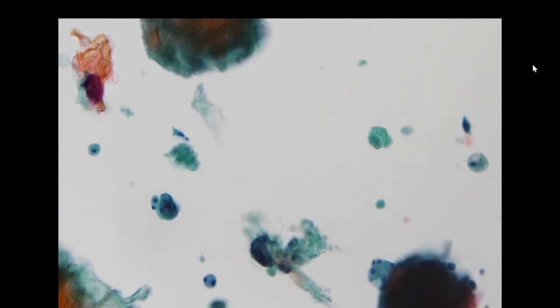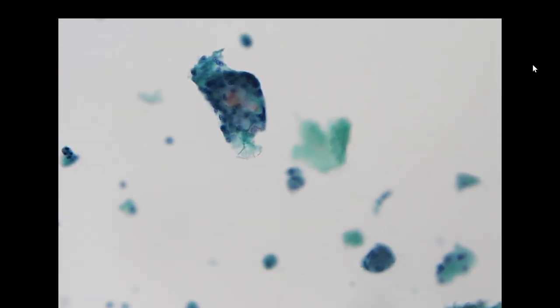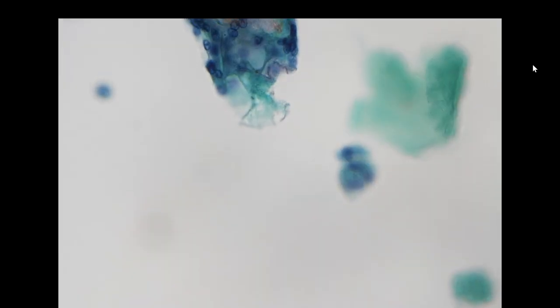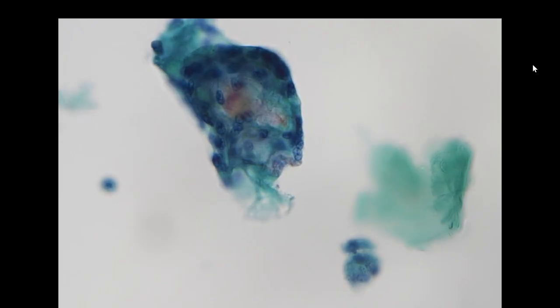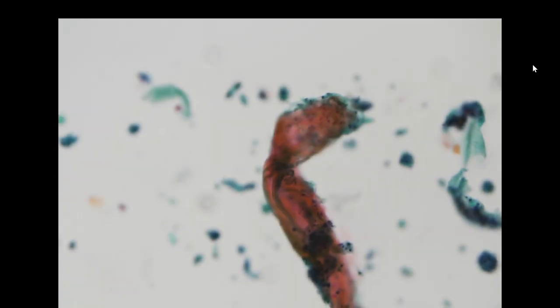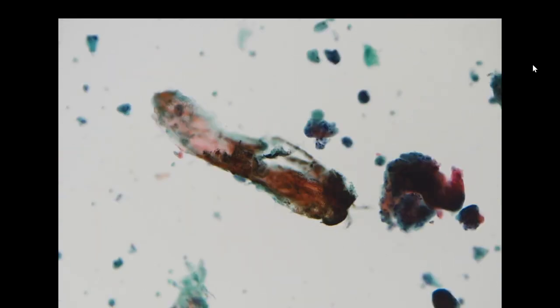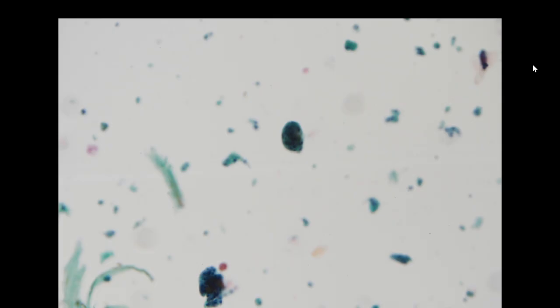Squamous cell carcinoma sometimes can also induce prominent granulomatous inflammation if it is well differentiated, highly keratinized. But the clue is that we need to search for the atypical parabasal cells. In this case, we do not see any of them. Additionally, this is coming from a 24-year-old female. It is highly unlikely that the patient will have a squamous cell carcinoma. And additionally, the patient actually had an aspiration at the same site exactly 1 year ago.